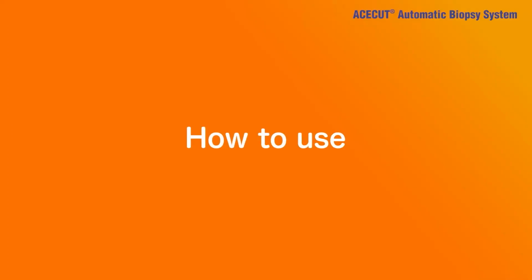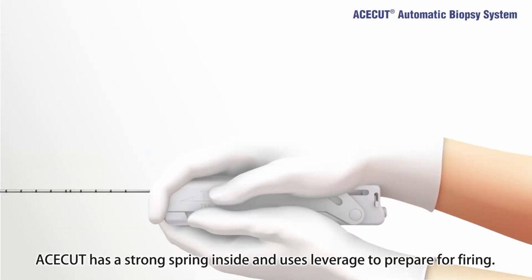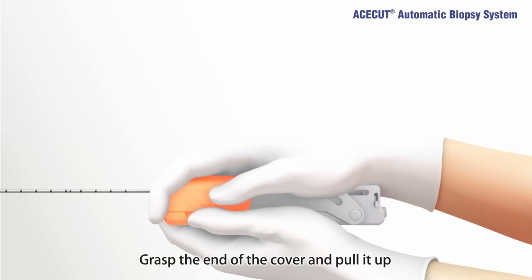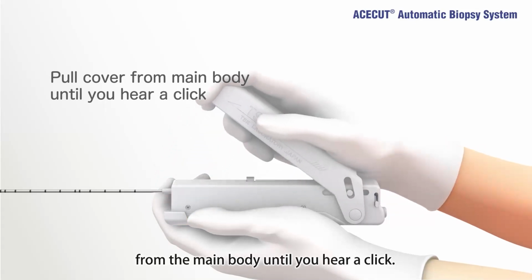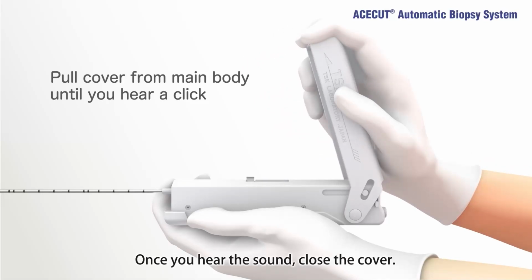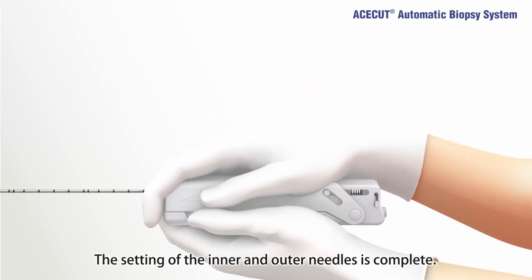How to use. First, set the safety switch from its original position to the lock position. ACECUT has a strong spring inside and uses leverage to prepare for firing. Grasp the end of the cover and pull it up from the main body until you hear a click. Once you hear the sound, close the cover. The setting of the inner and outer needles is complete.